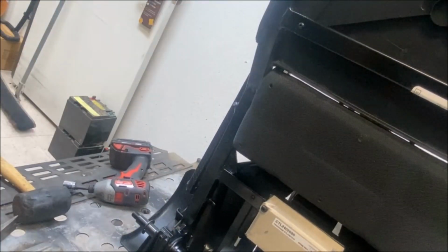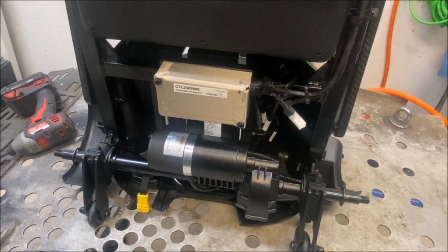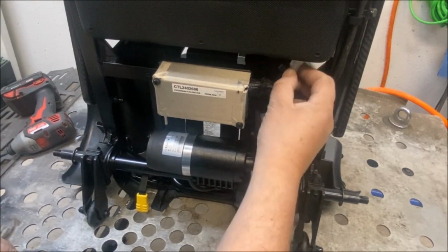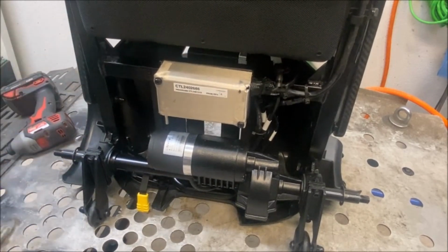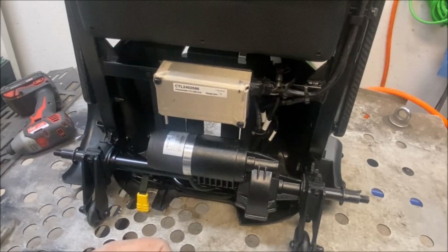Okay. Stand it up. I've got one on. It's a good time to check your wiring. Make sure it's tucked out of the way. Alright, so I've got this one all set up. I've got my insert. Looks like the insert's already in on this side.